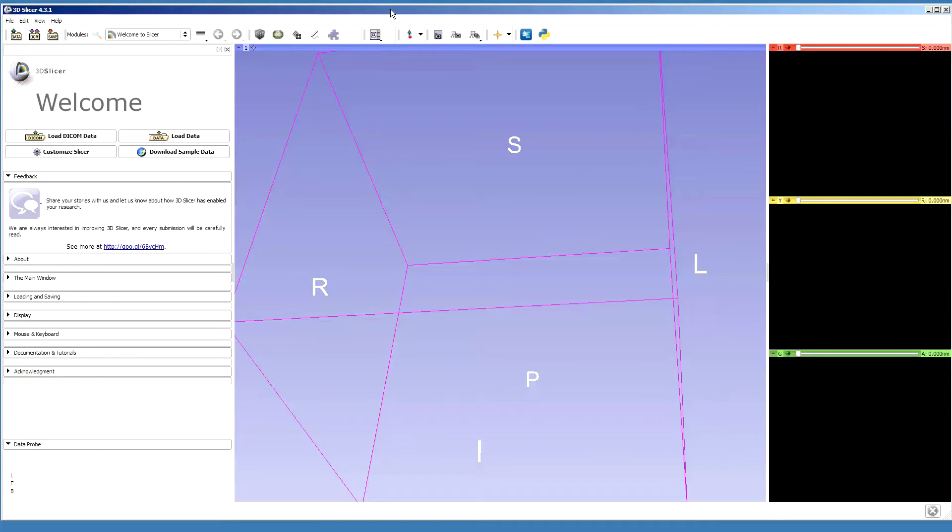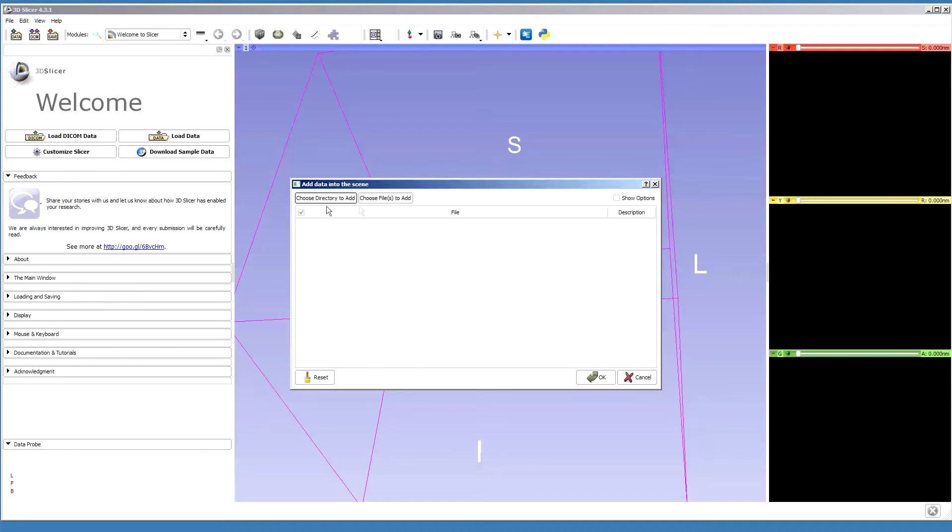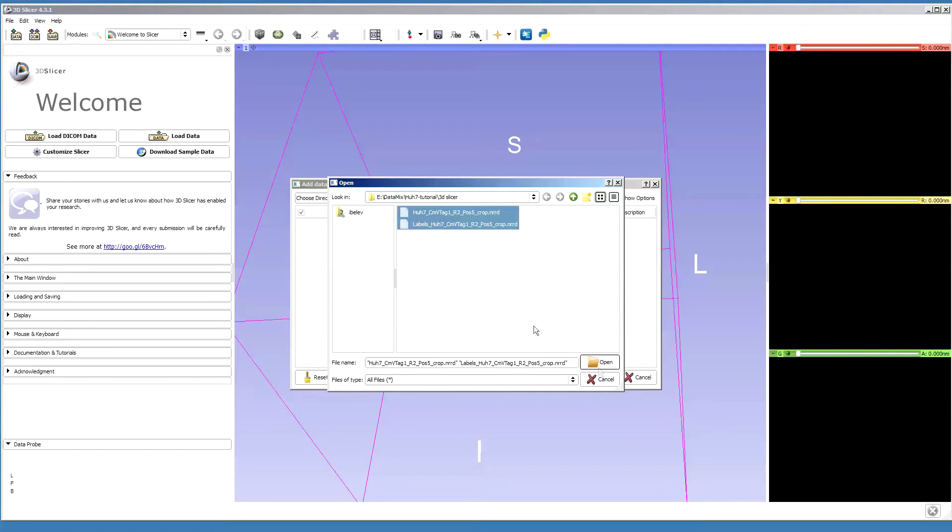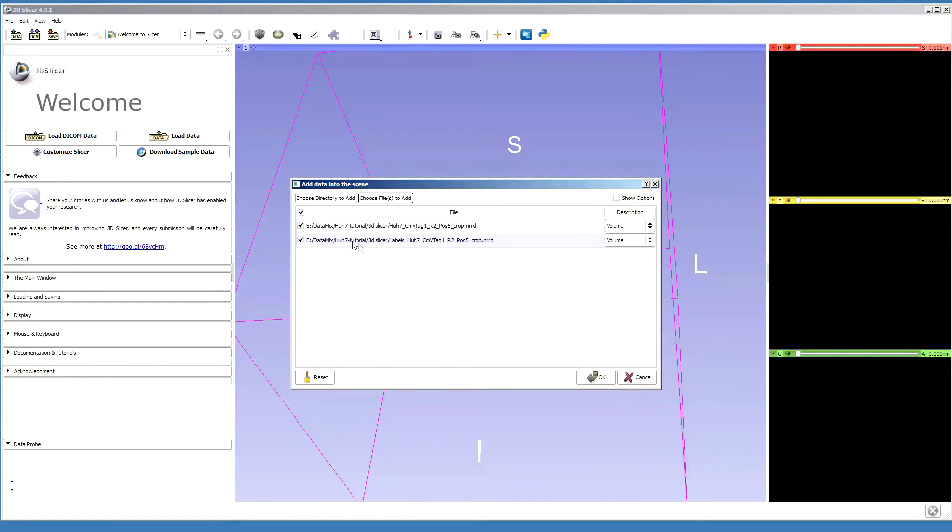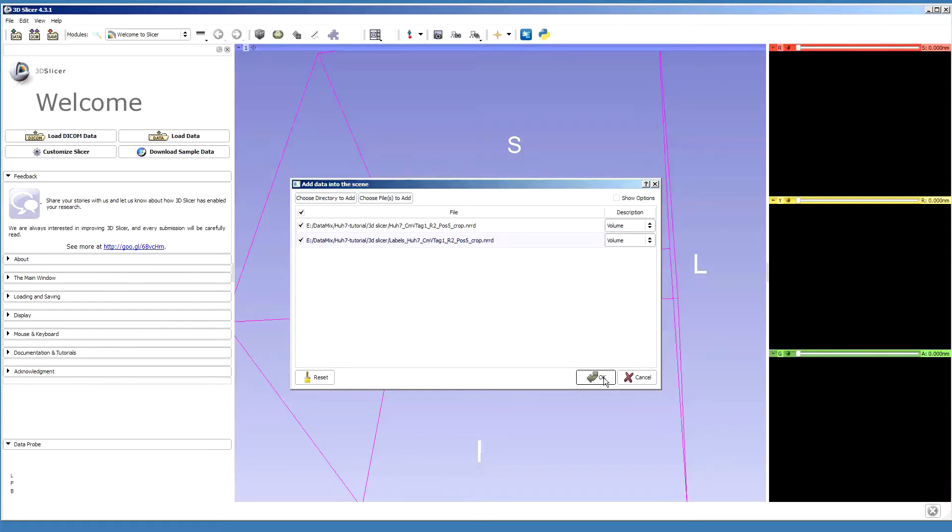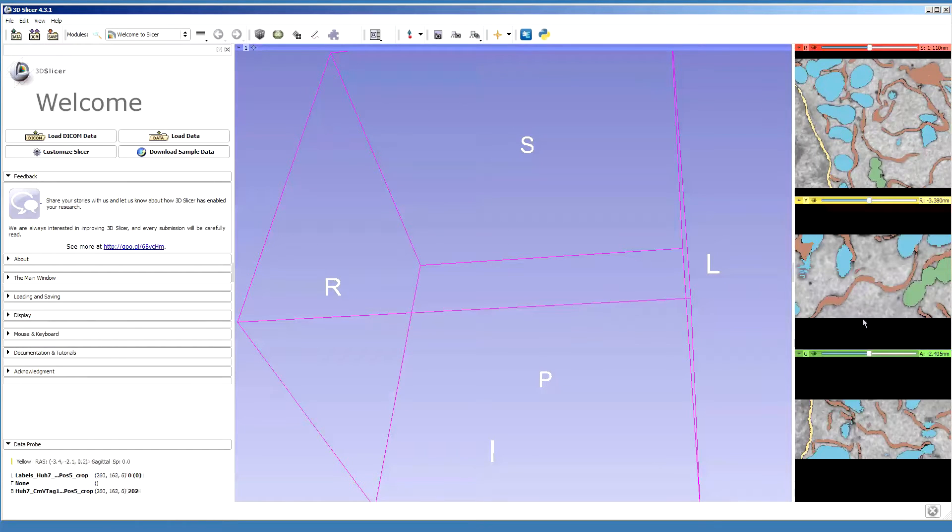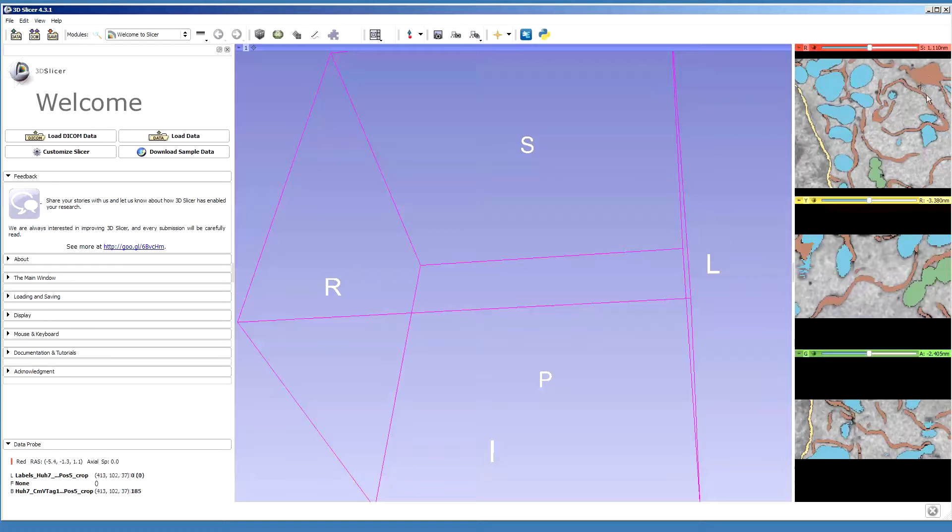The first thing to do is to open data. We click on this data button and then choose files to add and select both of our materials and then click OK. So the volumes are open now, and you can see there is a dataset and above this dataset there is our model.